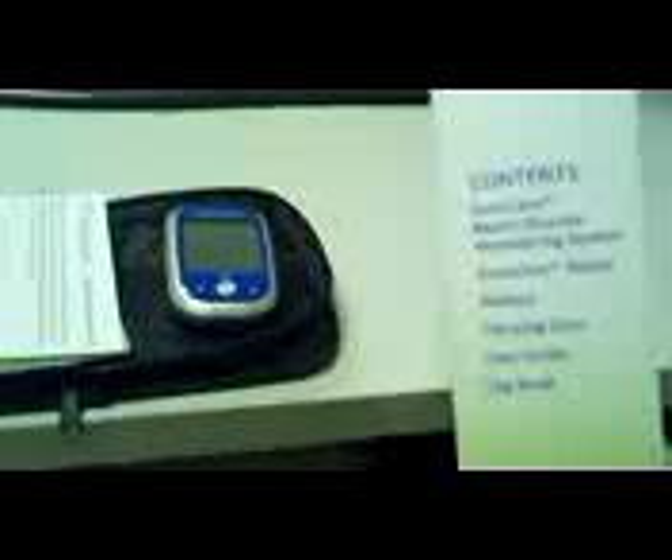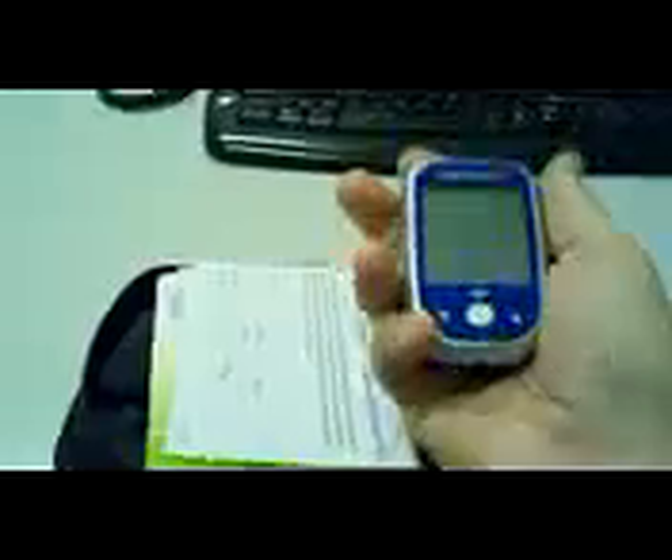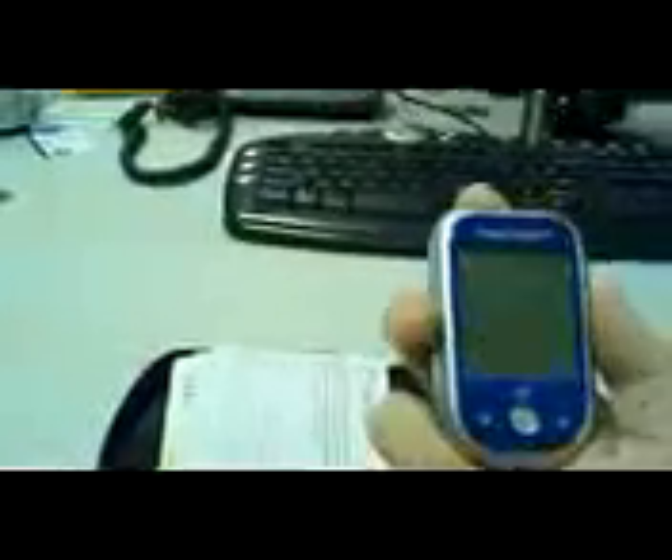The contents of this unit include the battery meter, carrying case, user guide, log book, and obviously the system itself — this is what comes in the box. One thing I've noticed in all the years we've been providing diabetic supplies and equipment: this is about the size of my two fingers, which is actually pretty small — probably the smallest I've seen in the industry. It comes with this nice little carrying case, which is part of the kit, along with the user guide and record book, and the warranty information.